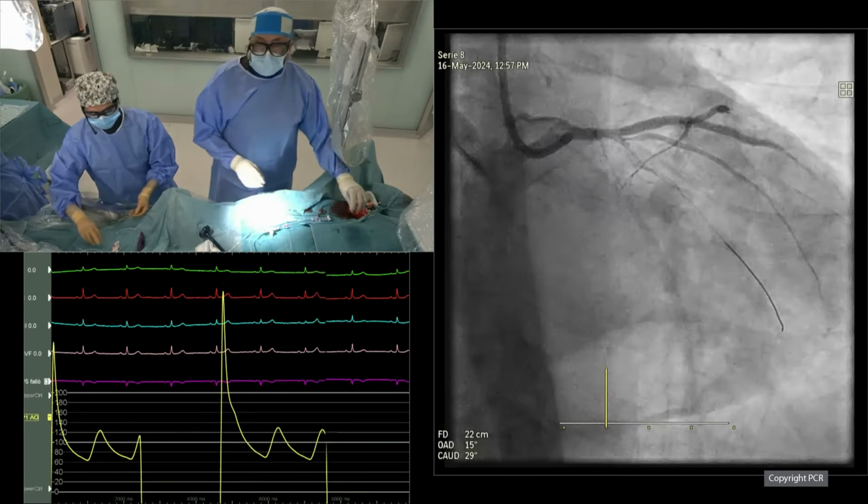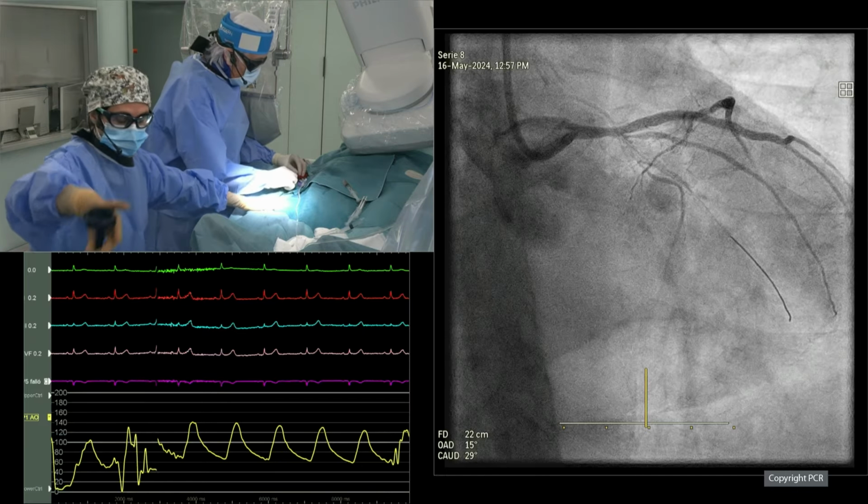So that's a question for the panel here while they are working. Nieves can comment, just go on. Javier, we'll try to discuss some points here in the panel, because the audience would like to know what is the difference between high and low speed. What is actually the effect on the plaque in terms of modification? Is there any specific anatomic setting where you would say, you know what, I'm going high speed?